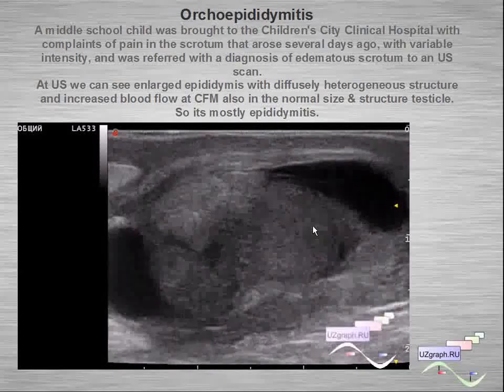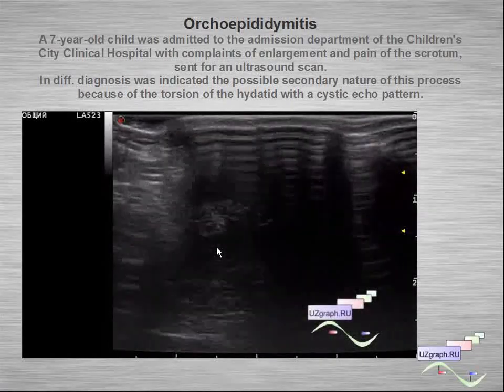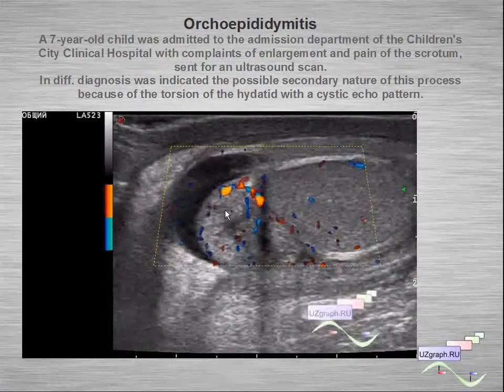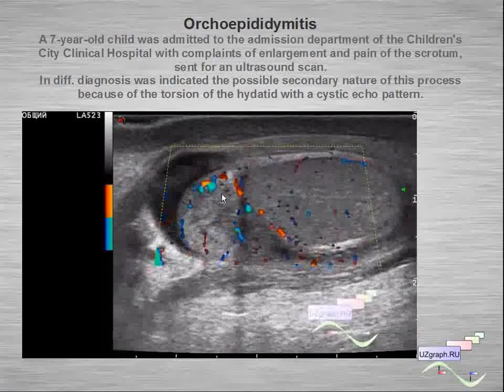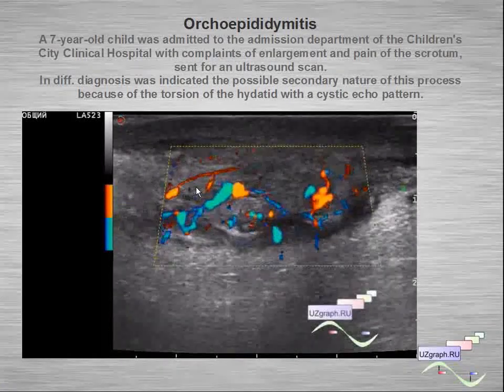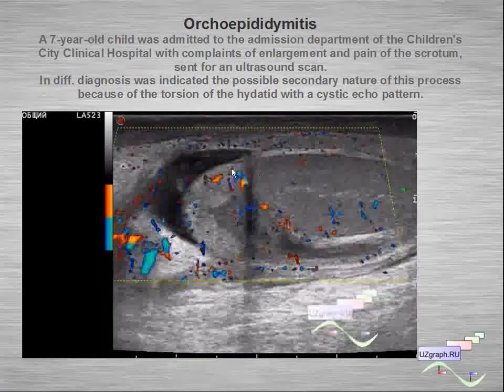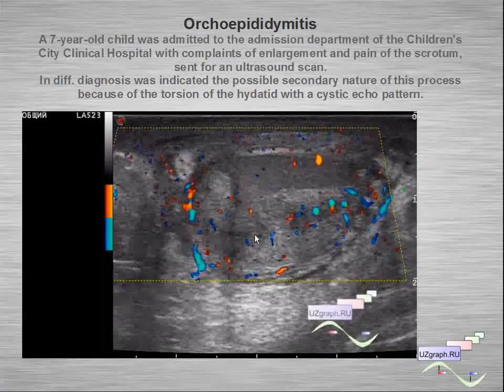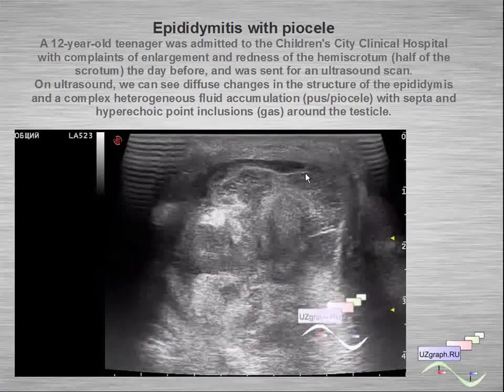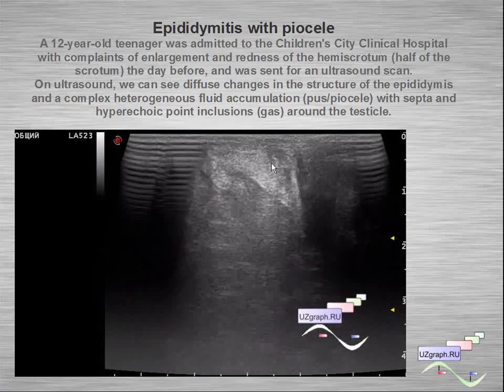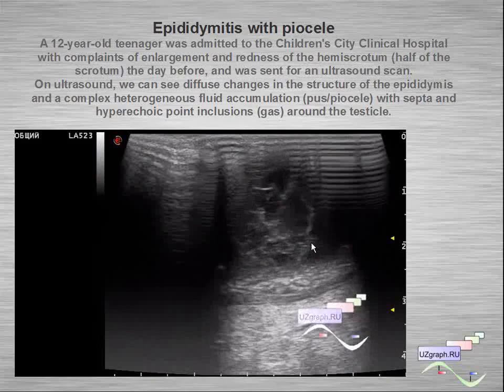Another example of orchido-epididymitis with a heterogeneous enlarged epididymis with a cystic structure inside, which could be an appendage — possibly a torsion of the appendage. We can also see increased blood flow at color flow mode. Another example with pyocele showing a lot of fluid content with septum and hyperechoic point inclusions like gas.